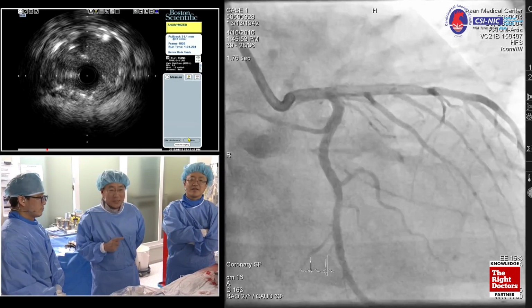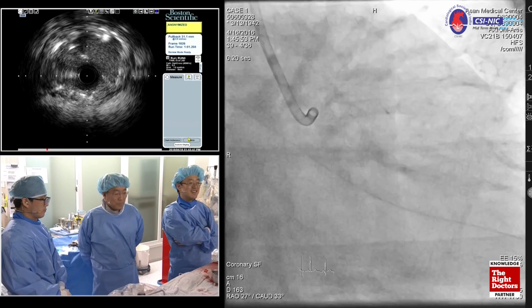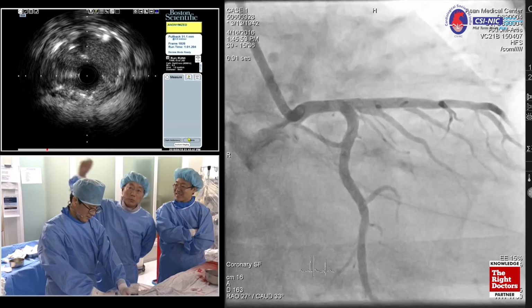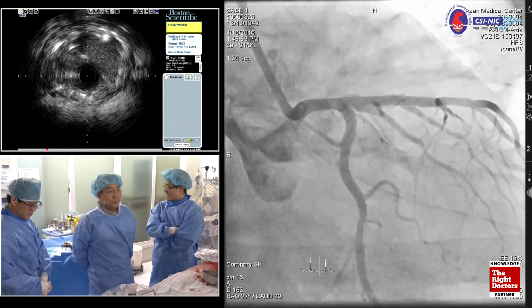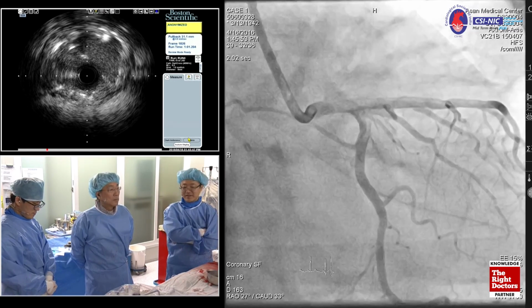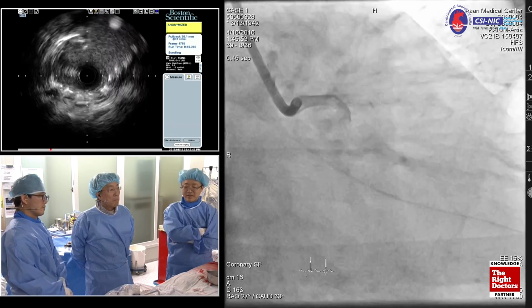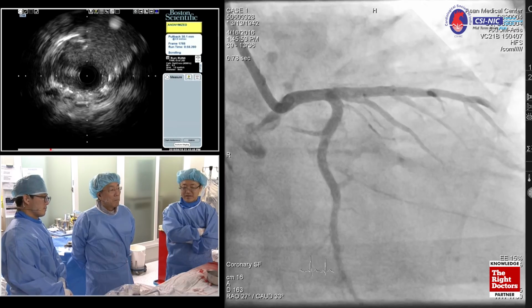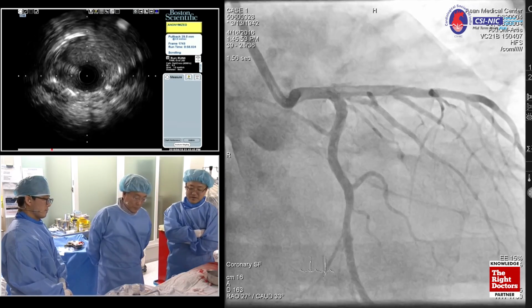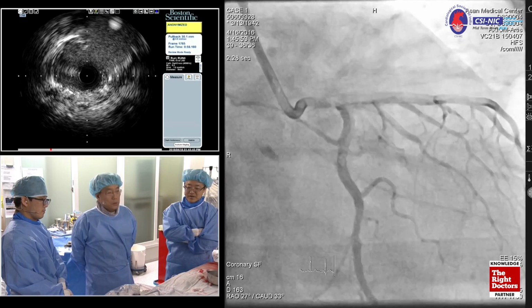So this is the first case. Maybe we don't have enough time, but if you want, we're going to show us the other case. Second case. Dr. Bach, this is an ISR case, main bifurcation. If you see, the balloon response is not favorable for the DEB, so if you have to do another separate stenting, what will be your most preferred strategy for the poor response to balloon angioplasty for the another stenting strategy? What is your preference? The culotte or another?